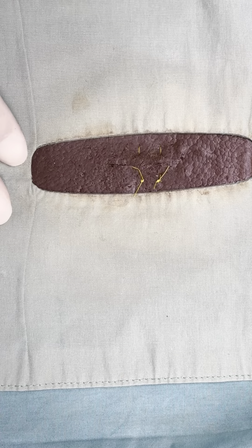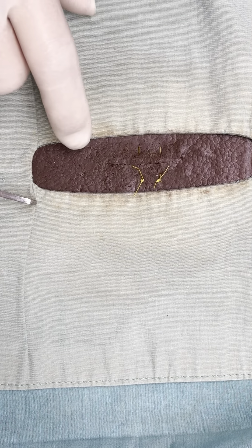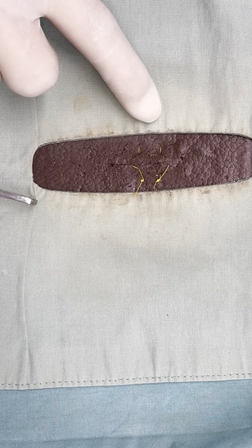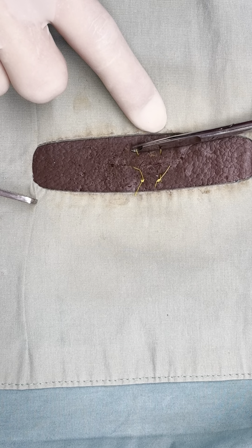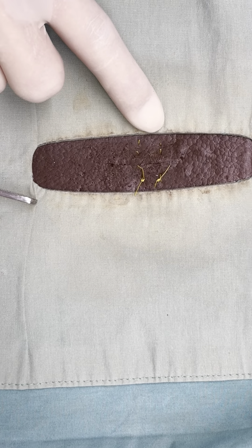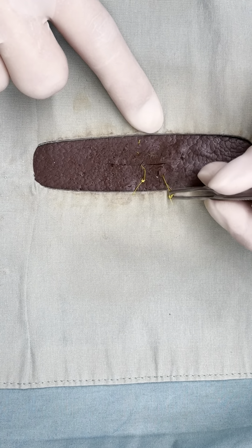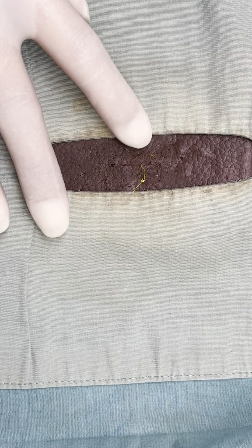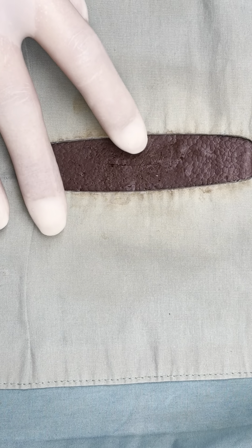Now to remove your vertical mattress patterns, you're just going to cut on the side closest to you — that's going to be the side that you don't have a knot — and then with our thumb forceps we would extract those sutures. And that is your vertical mattress pattern.